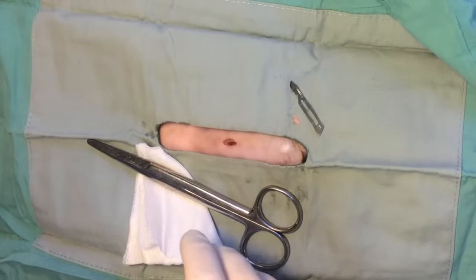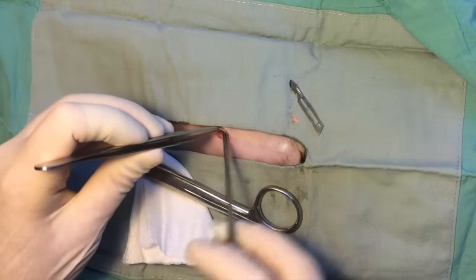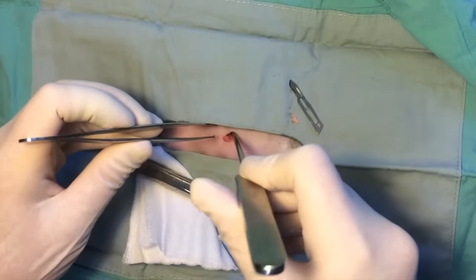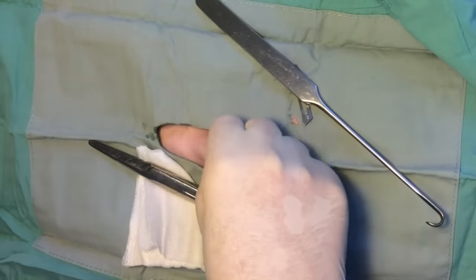The uterus is located using a spay hook. The body wall is tented and the hook is placed in the abdomen and directed down the body wall with the point of the hook pointing caudally. The point of the hook is then directed medially and swept upwards to catch the uterine horn or broad ligament.